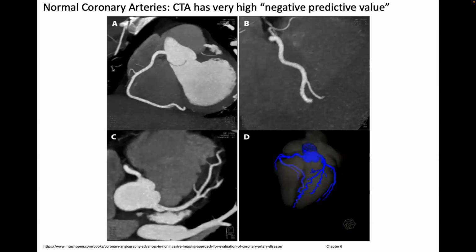So as a decision point, if you're somebody who has intermittent chest pain and you go to the hospital, the question is, should you be worked up for cardiac disease, for coronary disease? Should you get on the treadmill? Should they check you in overnight and take your ECG for 24 hours, et cetera, and do a stress test? If the first thing you do when you walk in the door is have a CTA and it's negative, you can just go home. Take some Rolaids because you've got indigestion or something, and go home.